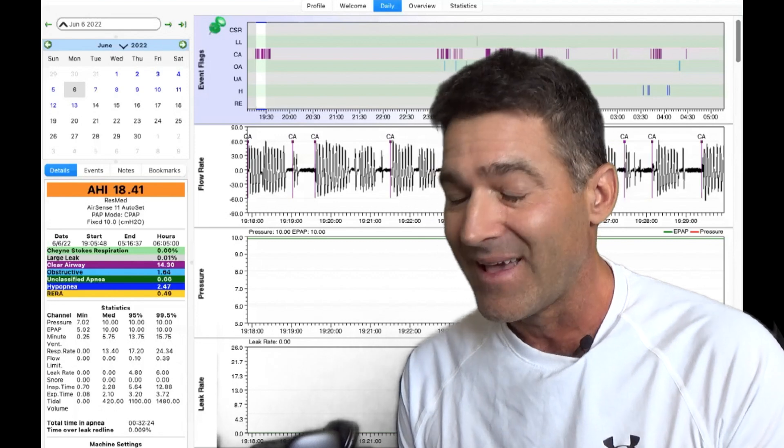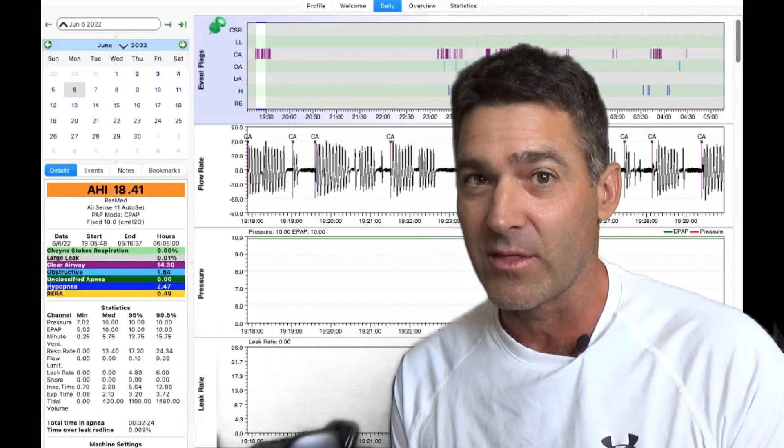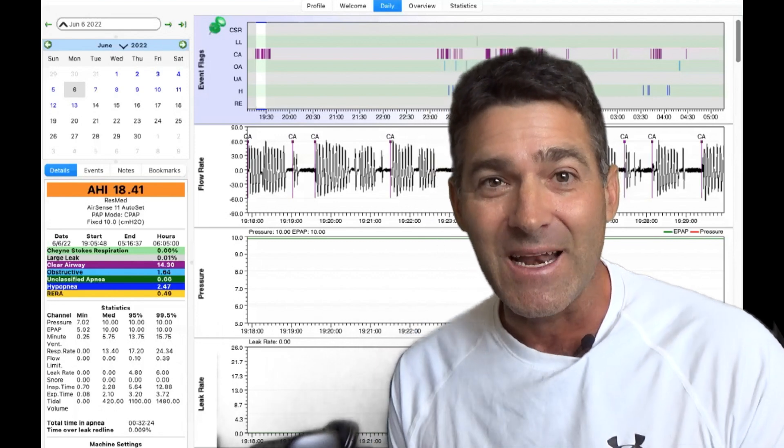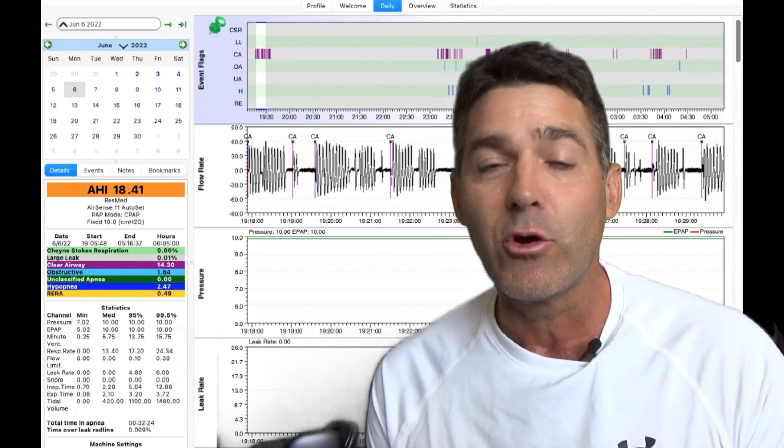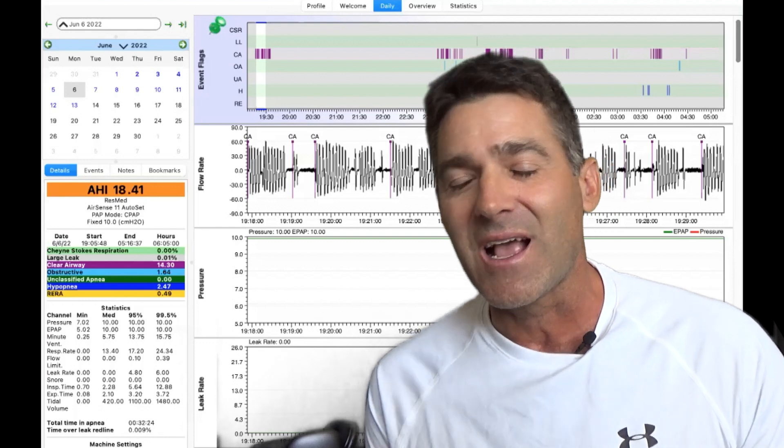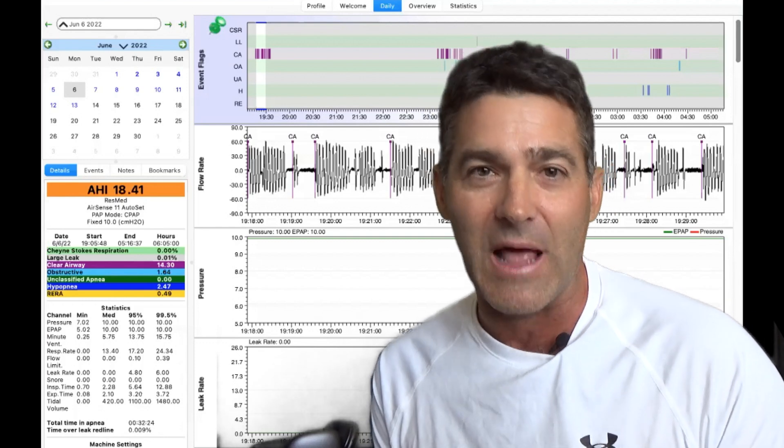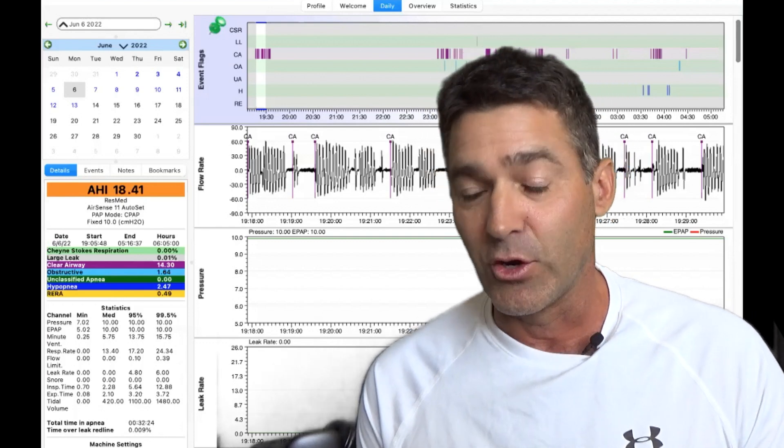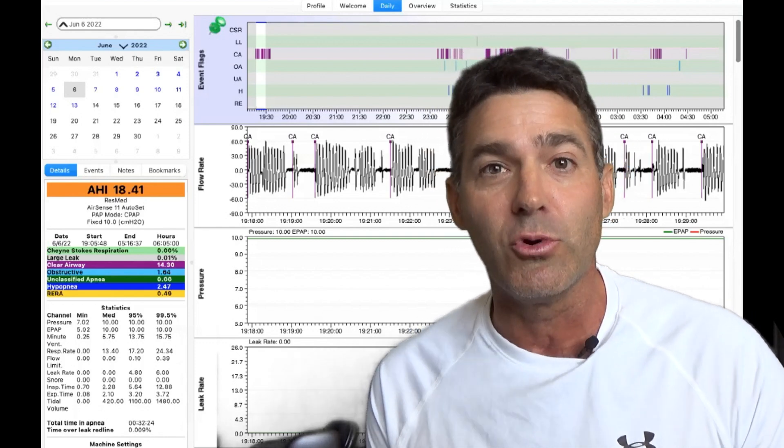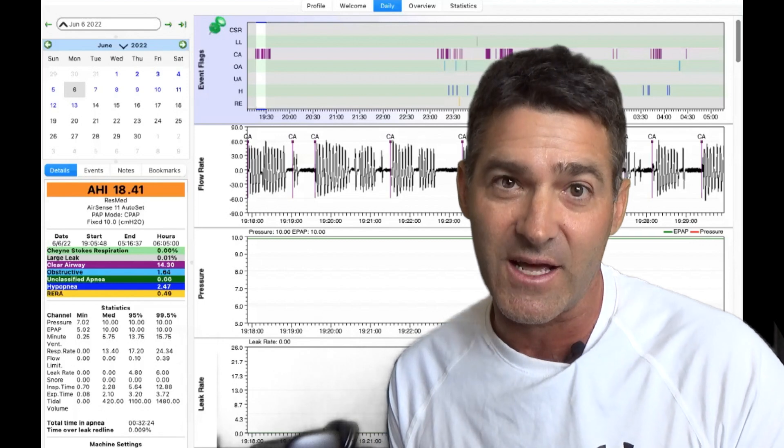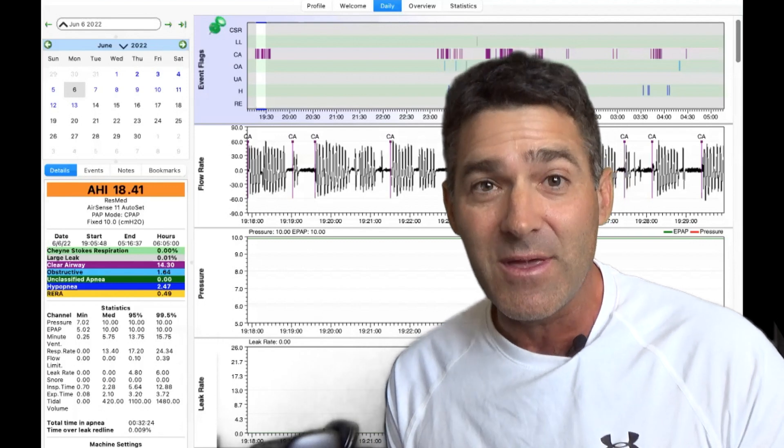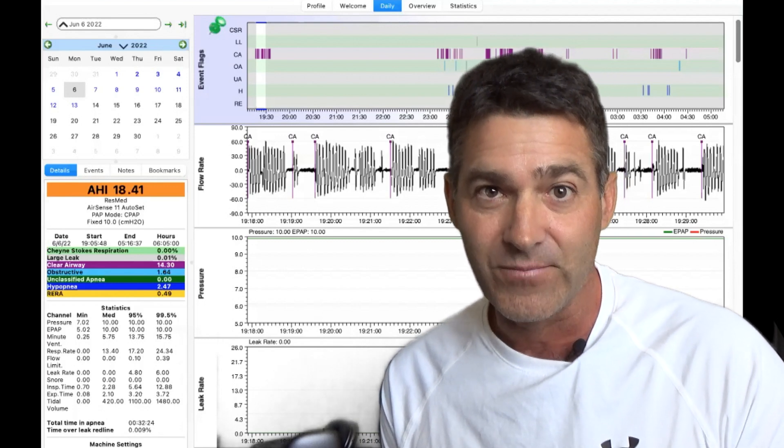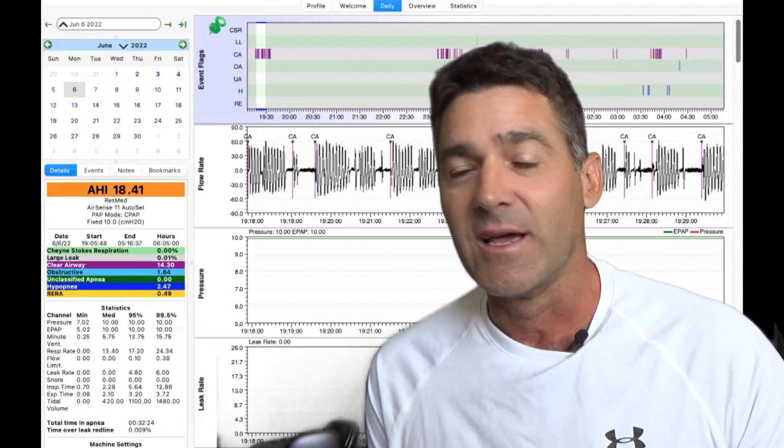We have our good friend, Periodic Breathing. Periodic Breathing is a hot mess. I don't know if you've ever seen clusters of central apneas or clear airway events in your Sleep HQ or your Oscar data, but maybe this will shed some light on it. Let's take a look.